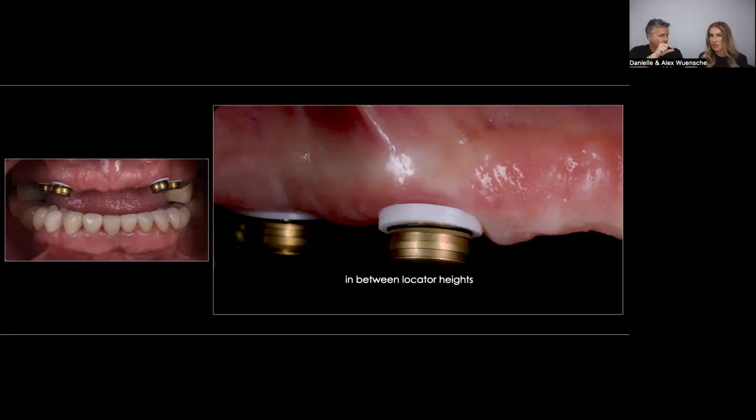There are like 4 or 6 of them in every kit. And this is important because the heights are clearly different in this case too. Also important, if you do locator pickups, they are included in your regular locator kit, also the fixed locator kit. Keep them.